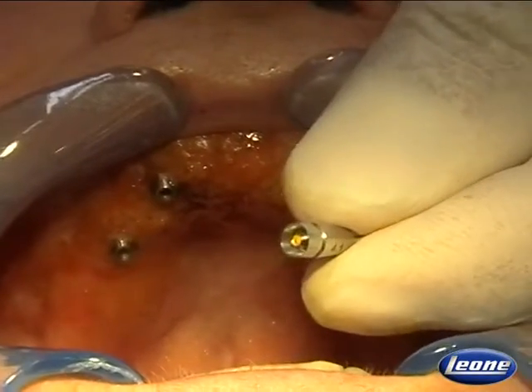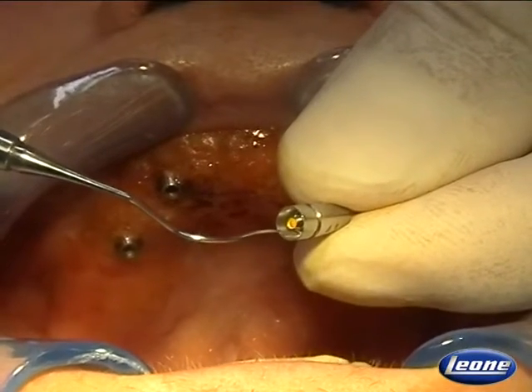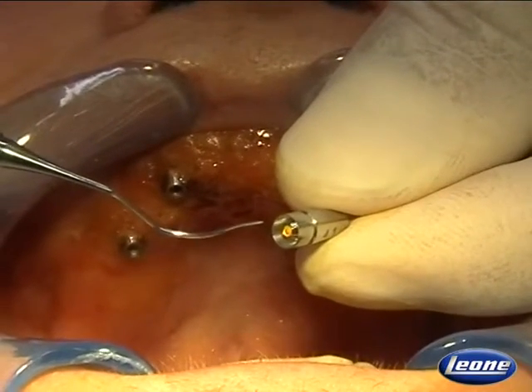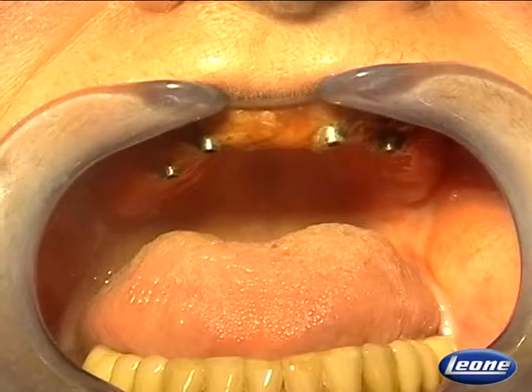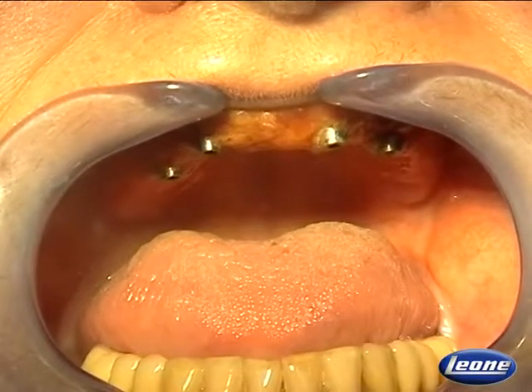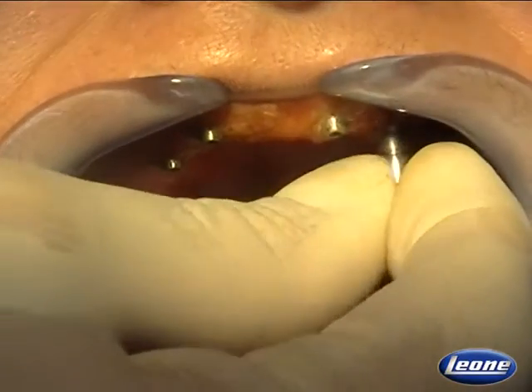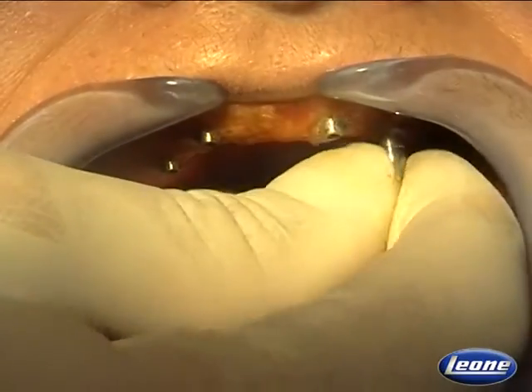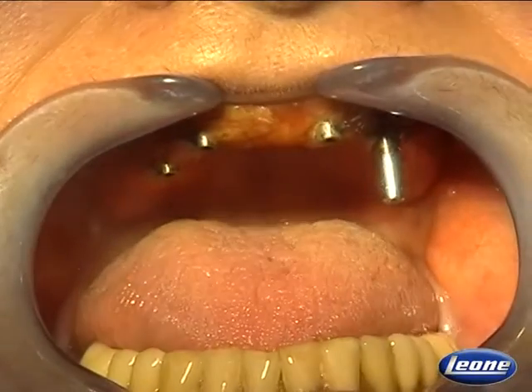To do so, we use these transfers. The yellow color code indicates a diameter of 4.1 mm. The transfer is also laser marked. I screw the transfers onto the abutment all the way to the stop and hand tighten them.